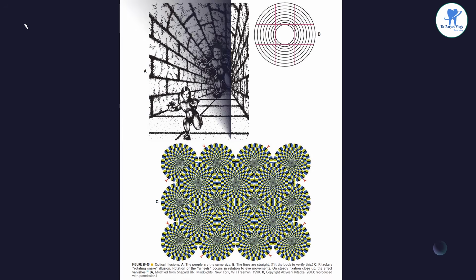An acceptable appearance may be obtained by incorporating visual perception principles into the pontic design. In the same way that the brain can be confused into misinterpreting the relative sizes of shapes or lines because of an erroneous interpretation of perspective, a pontic of abnormal size may be designed to give the illusion of being a more natural size.